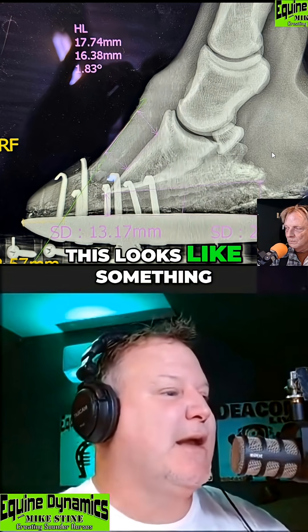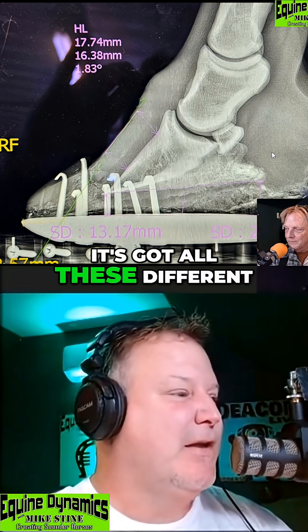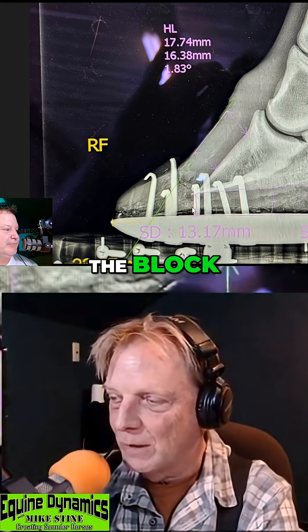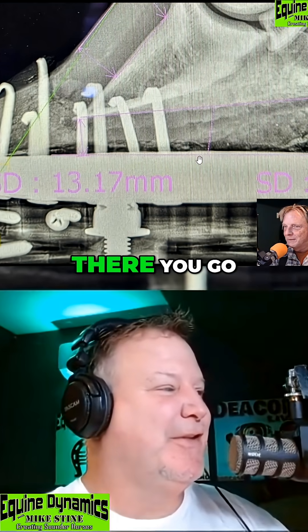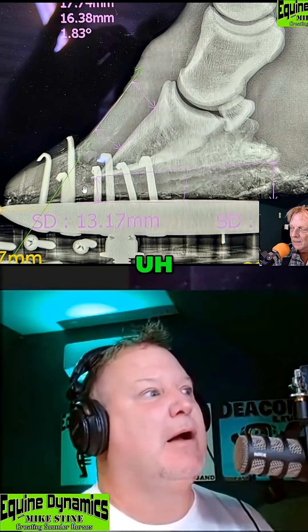Mike, this looks like something out of a Star Wars movie! It's got all these different dimensions — look at the nails and the edge of the shoe, and the screws and the block and all that. What would you call those materials as far as shooting an X-ray through it? Is that radiopaque? I think it would be — well there you go.